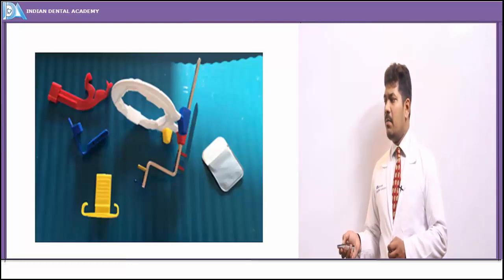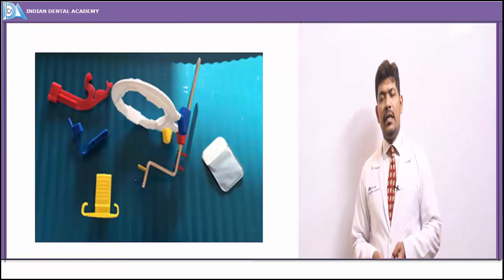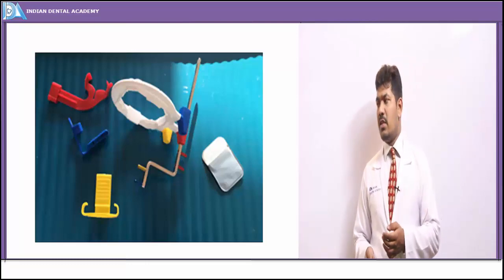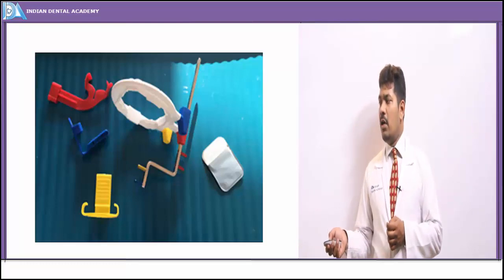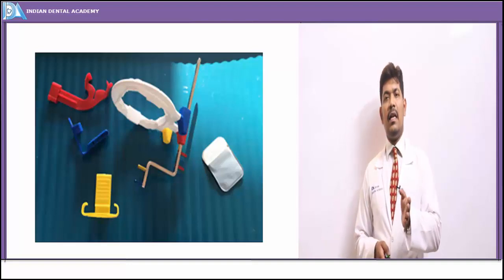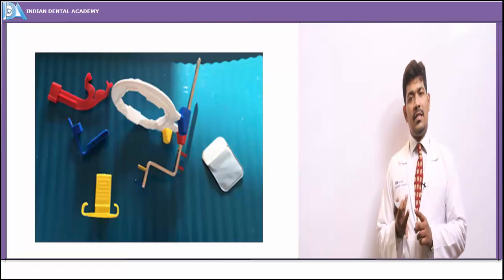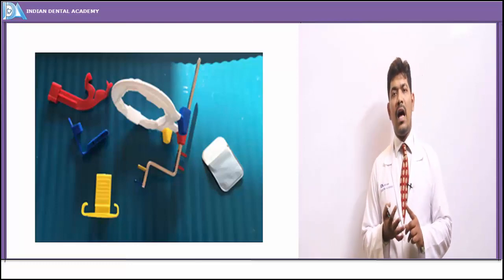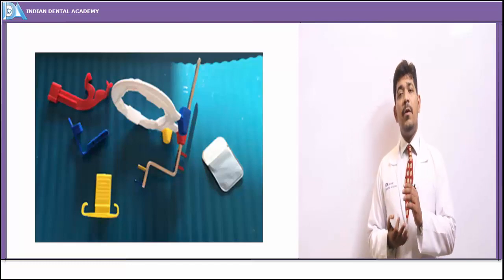The holding arm with the holders, depending upon which kind of tooth we are taking into consideration, be it anterior or posterior, that kind of bite block is used wherein the patient bites onto it, and then the holders on the bite blocks hold the specific film at a further distance away from the tooth. This provides stability and no arbitrary estimations of the image.